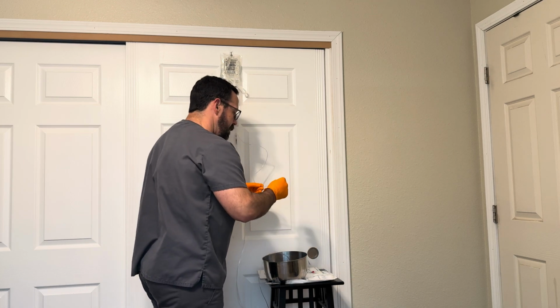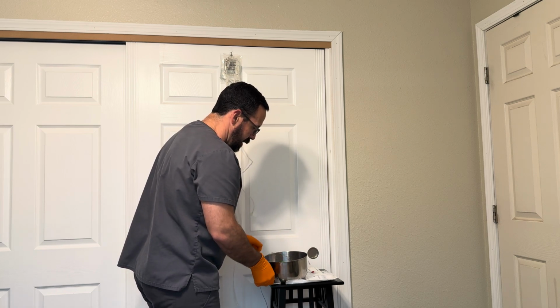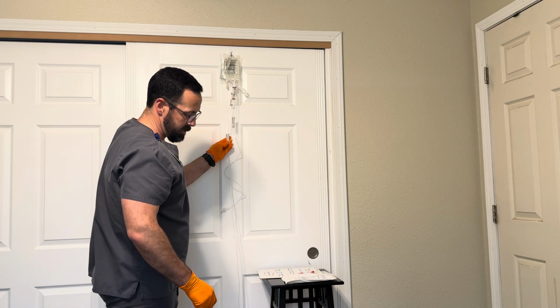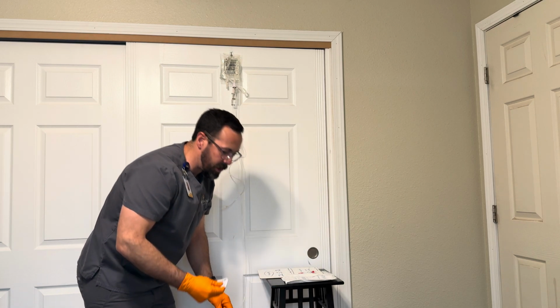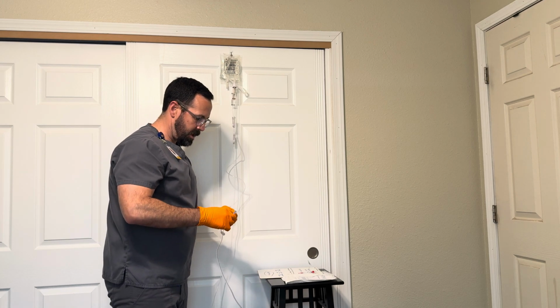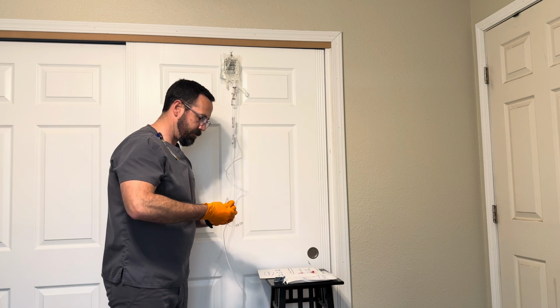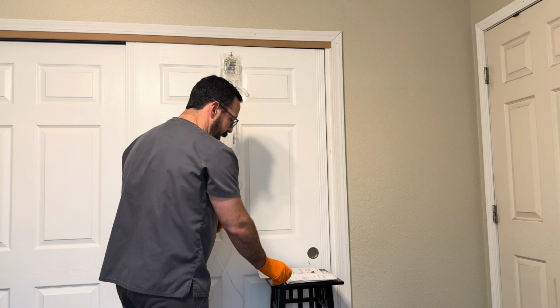I'm going to go ahead and put my cap back on. And then on my IV, this is still flowing at 38 drops per minute. I need to take an alcohol swab and clean my white port, because this is where the medication gets connected. So cleaning with an alcohol swab. I'm going to let that air dry for a moment.